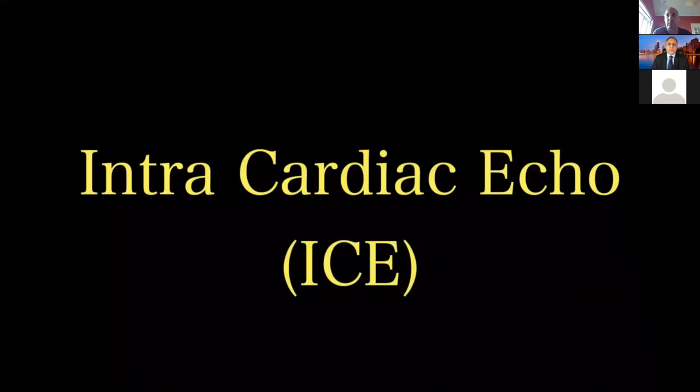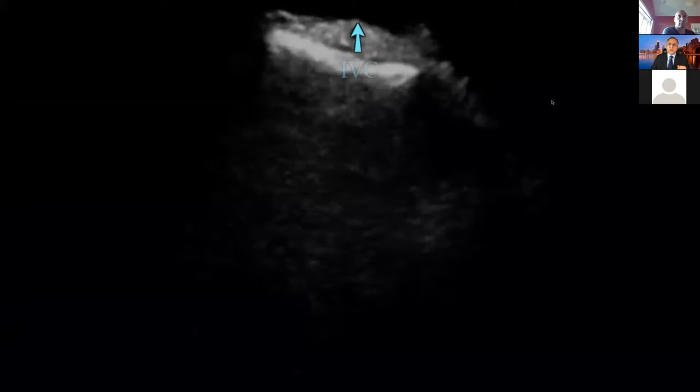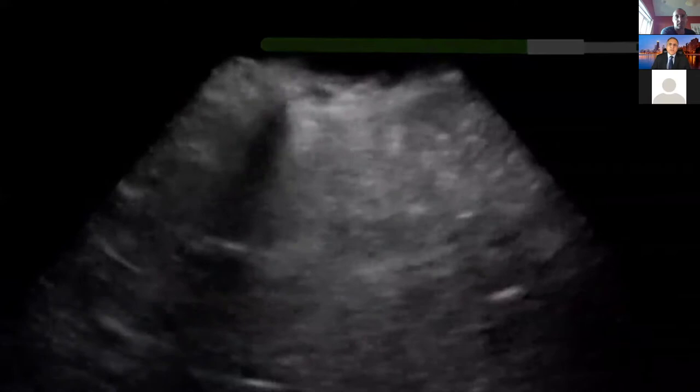Now let's talk about ICE. I always use a 10 French sheath — actually a long sheath on the left side — and go through the left side. This is the basic of ICE. I always have to talk about this basic — how you can differentiate where you are. As you notice here, you can see the IVC right there on the very top. When advancing, you always want to make sure you see an echo-free space in front of the leading edge of the ICE catheter. That is very important.